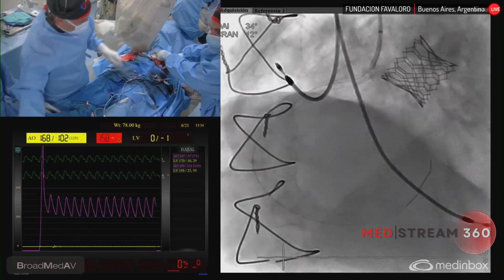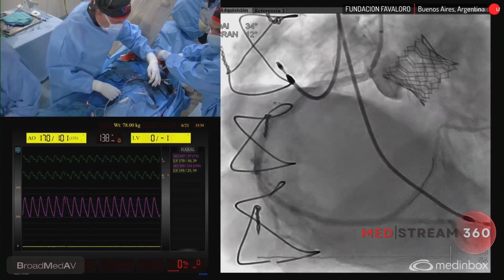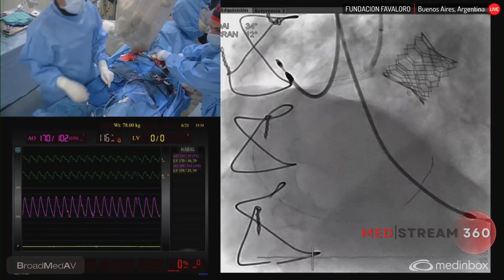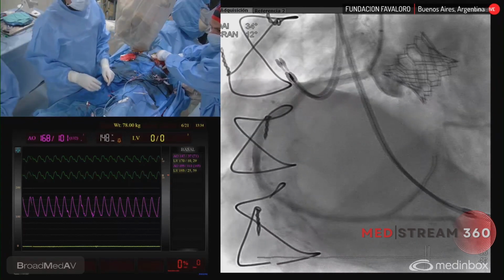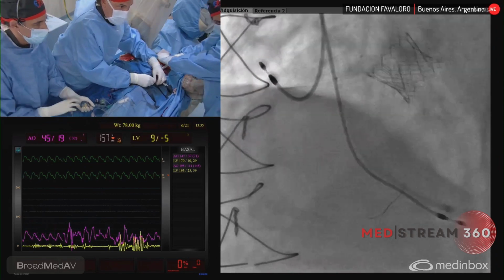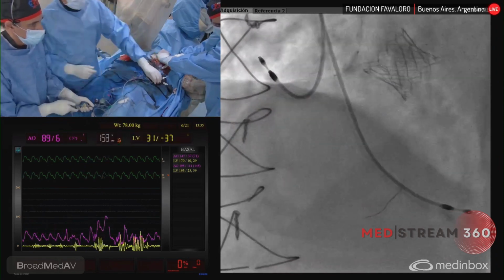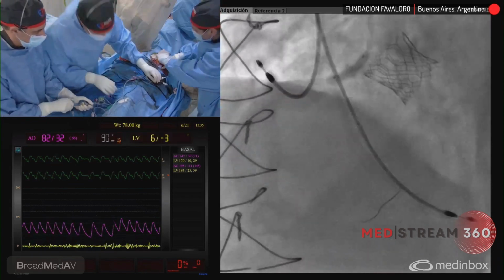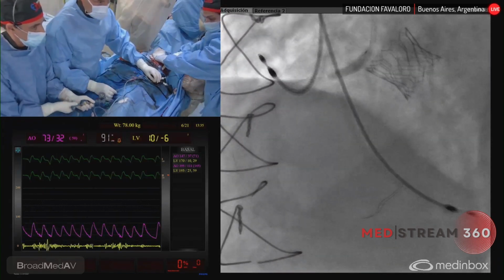I'm going to post-dilate this ostium, although I did an atherectomy, it is still a little bit compressed according to the angiography. I would really like to post-dilate to prevent any restenosis. We will take care of the ostium. Let's go slowly, but to high pressure, to 20, 22, 24. It's 3.5, 28. Okay, that's okay.